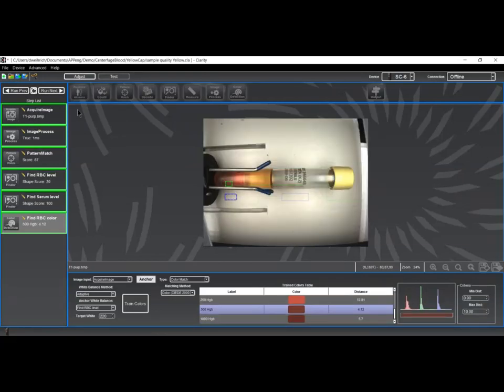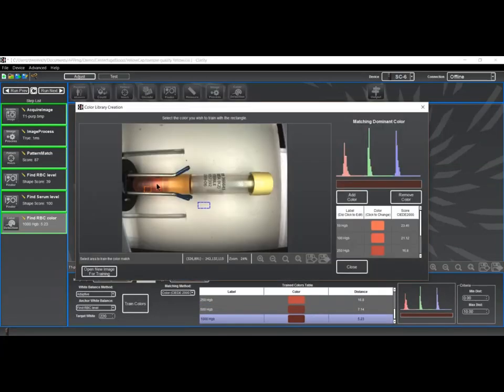At this point, let's take a short trip to the side here and discuss how I get this reference color table loaded into the script. I'm going to take and move this white balance area to the middle of the screen for this part of the demonstration. I have here a designation box that will give me the reference color that I'm seeking. And you can see that color is over here. If it's this color, it's over here. If it's, for instance, the cap color, which is useful for programming cap color detection, it appears over here. You can see each of these is adjusted slightly based on the white balance reference patch that I placed in the middle of the picture here.